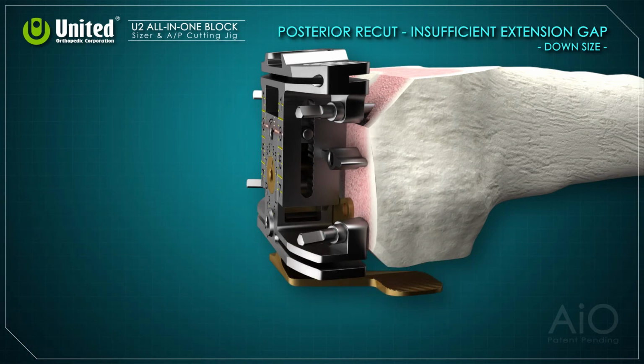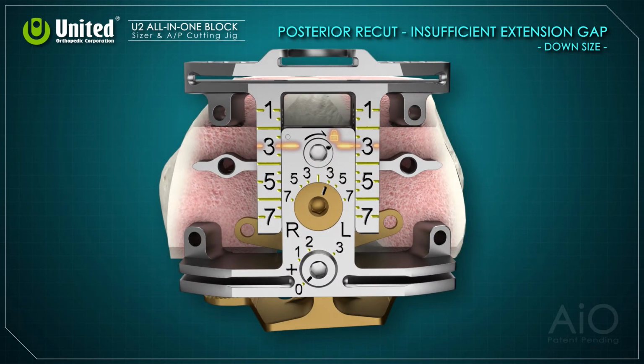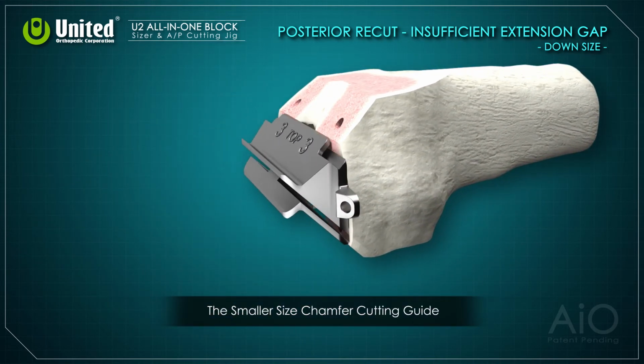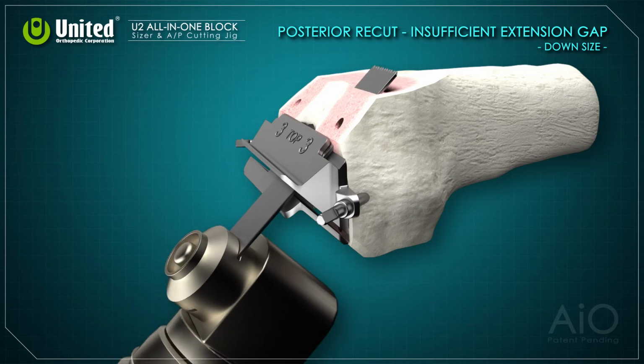If recutting is only to be done at the posterior side, the chamfer reference holes will match the smaller selected size. If both AP cutting levels are changed, new reference holes might need to be created.